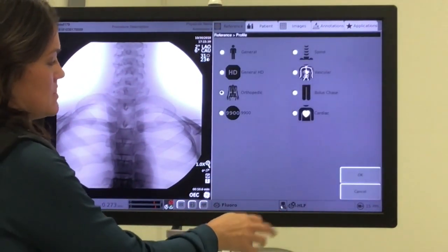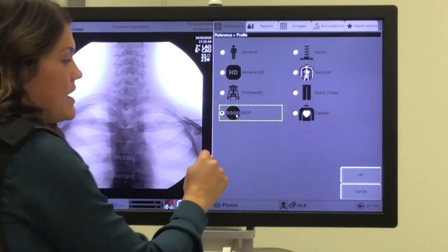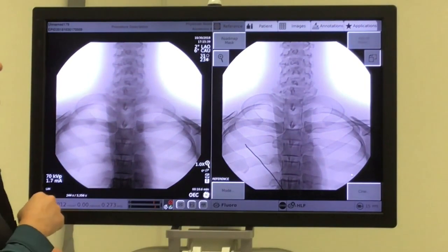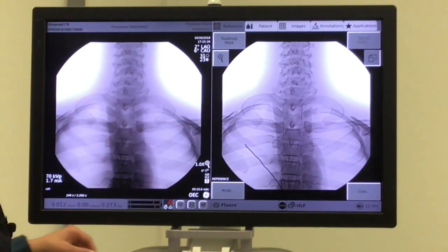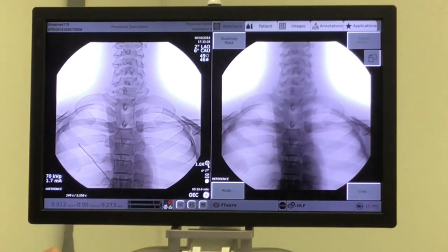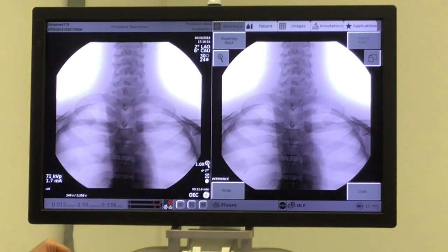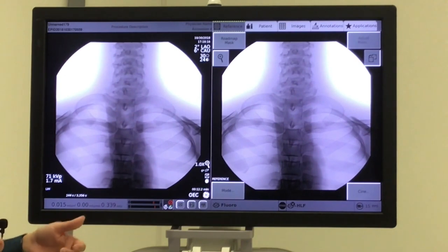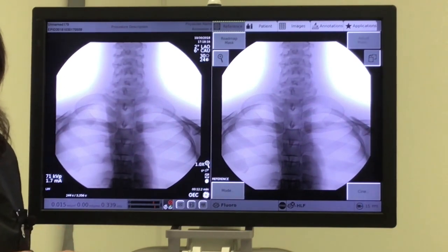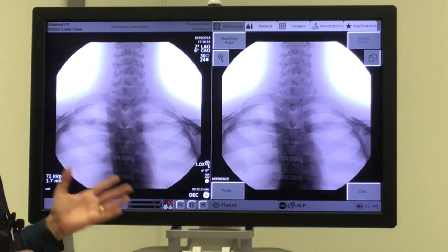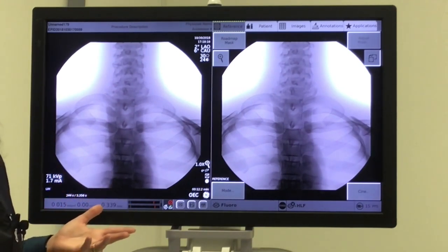The next on our list is going to be the 9900 profile. That's basically what it sounds like — it's going to try to make this image mimic what it would appear on a 9900. So it offers a little less detail and not as many shades of gray. If you have a doctor who's having a harder time adjusting to all the detail on this new C-ARM, you can give them this profile — sometimes it makes them happy.